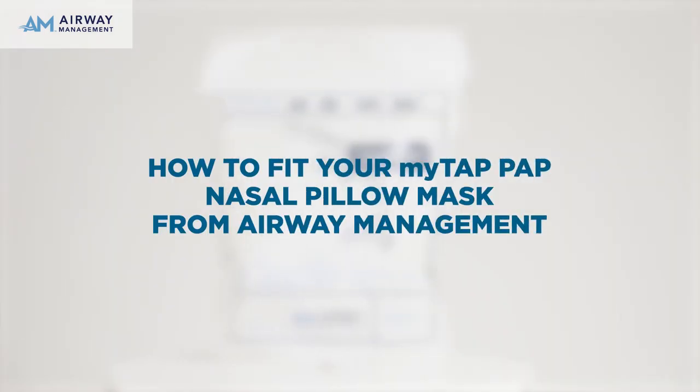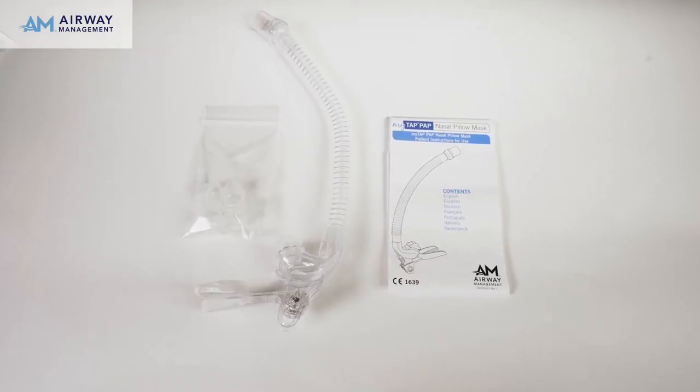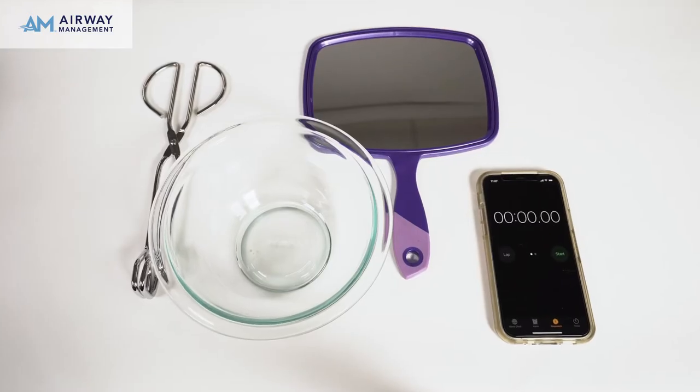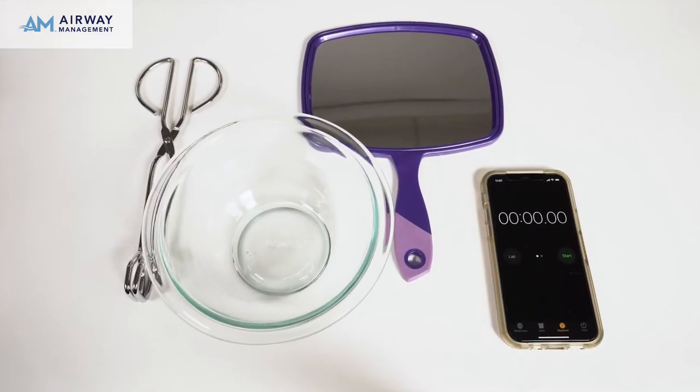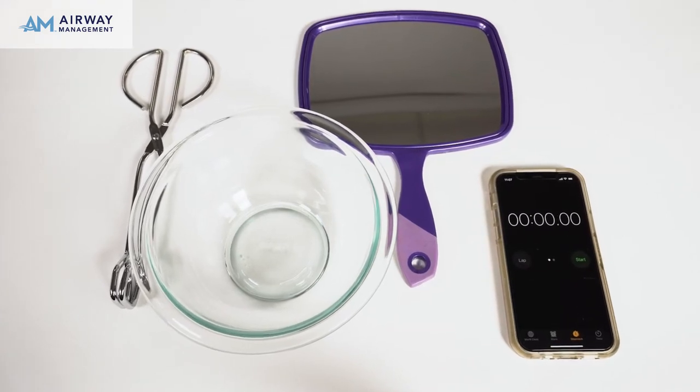How to fit your MyTap PAP Nasal Pillow Mask from Airway Management. Before fitting the mouthpiece, make sure to read all instructions and warnings. To fit your Thermacryl mouthpiece, you will need boiling water, a mirror, a timer, and a pair of tongs.